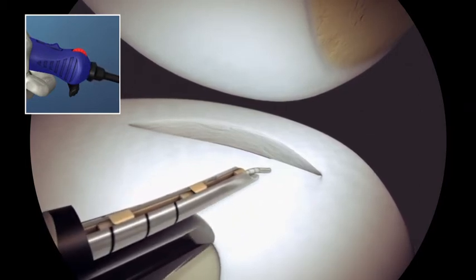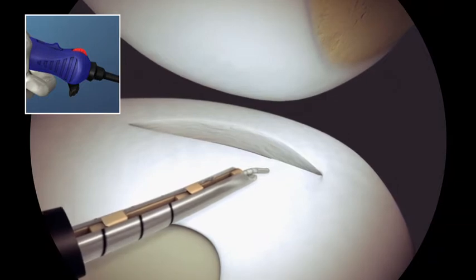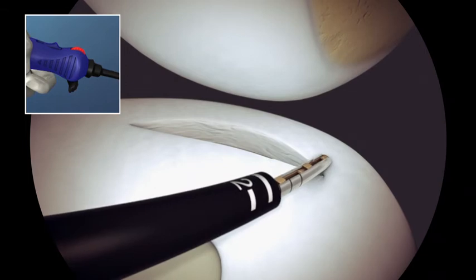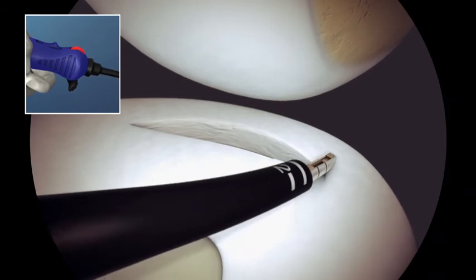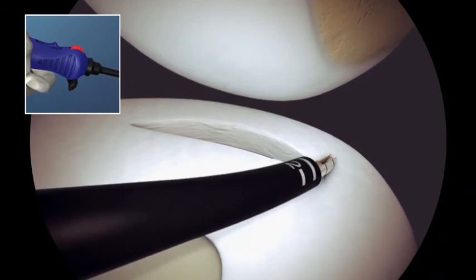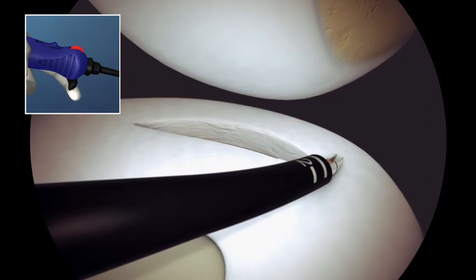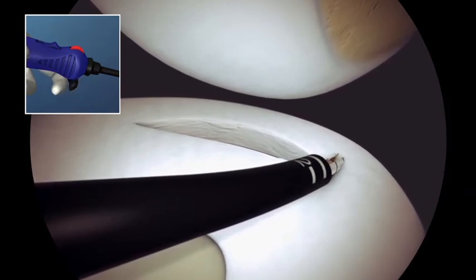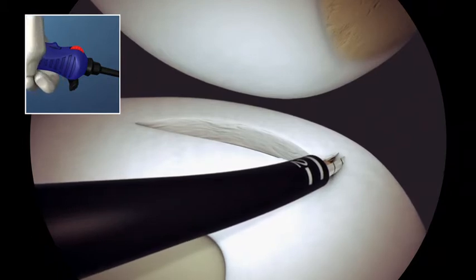Ensure that the switch is forward in the freewheel position and pierce through the meniscus. Use the needle markings to ensure the proper depth of penetration. To place the first implant, pull back and release the trigger to deploy an implant. Withdraw the needle from the meniscus.